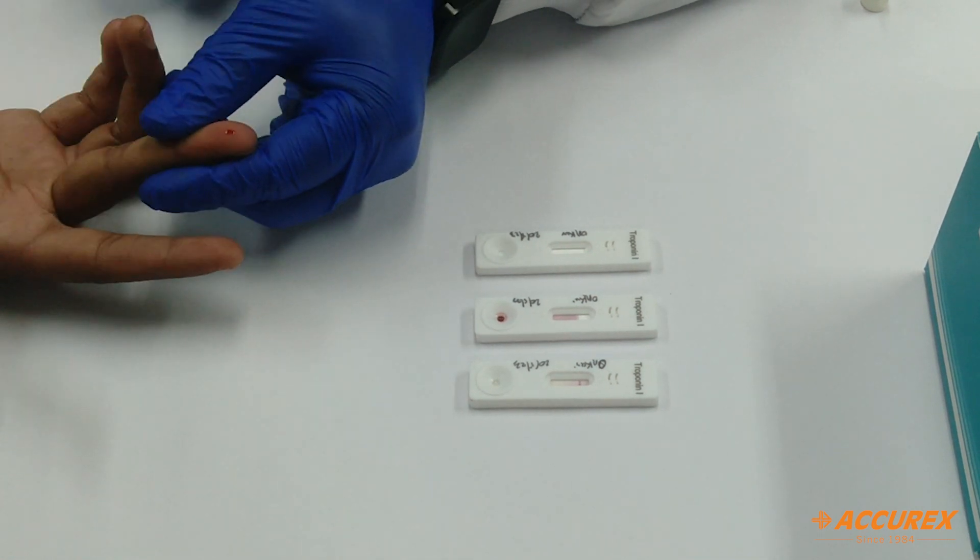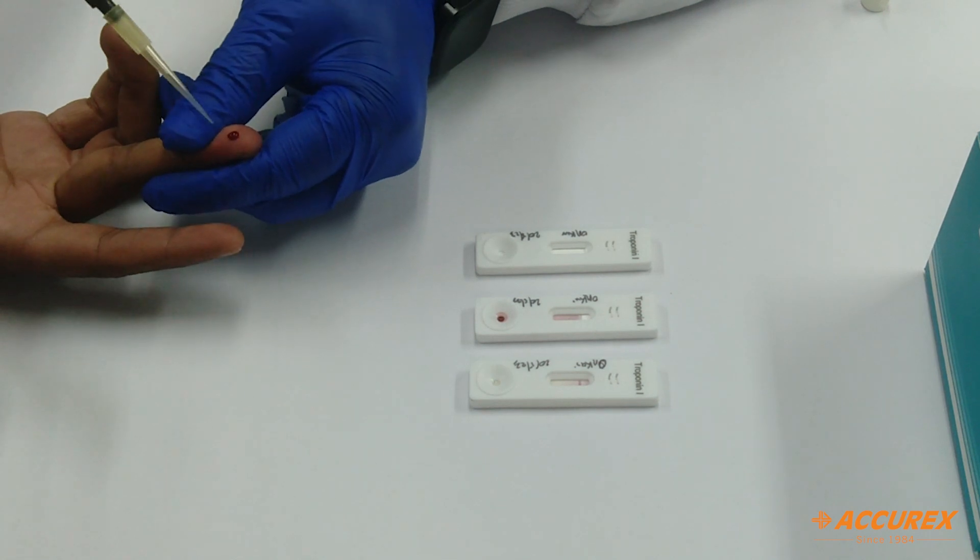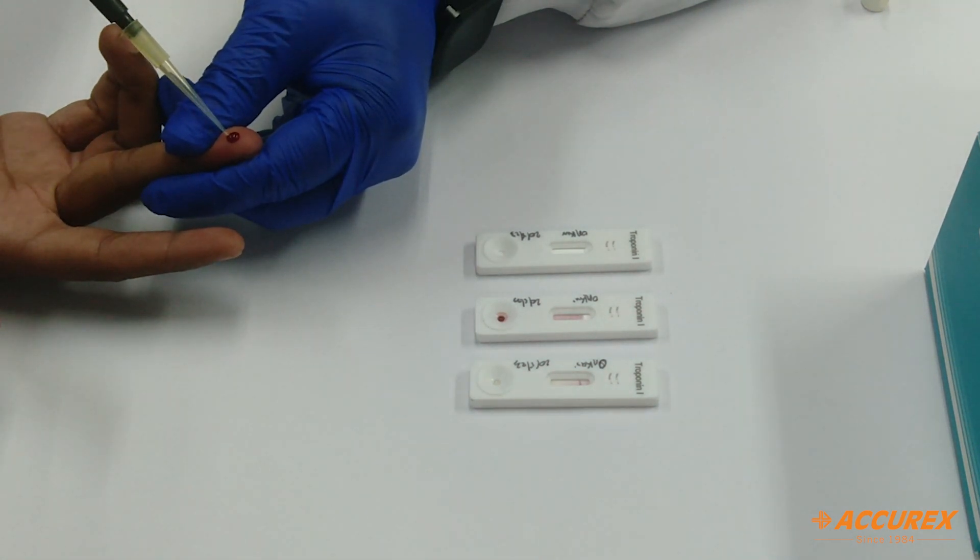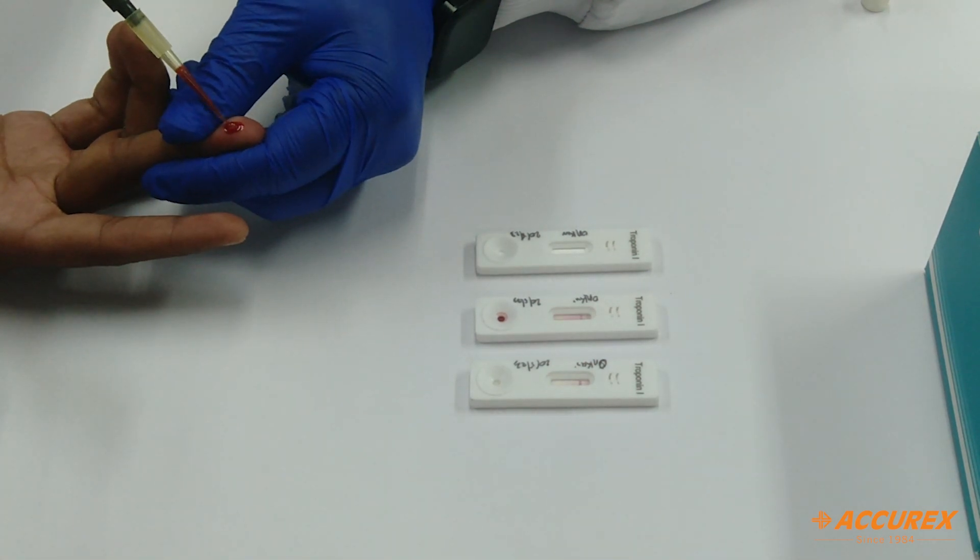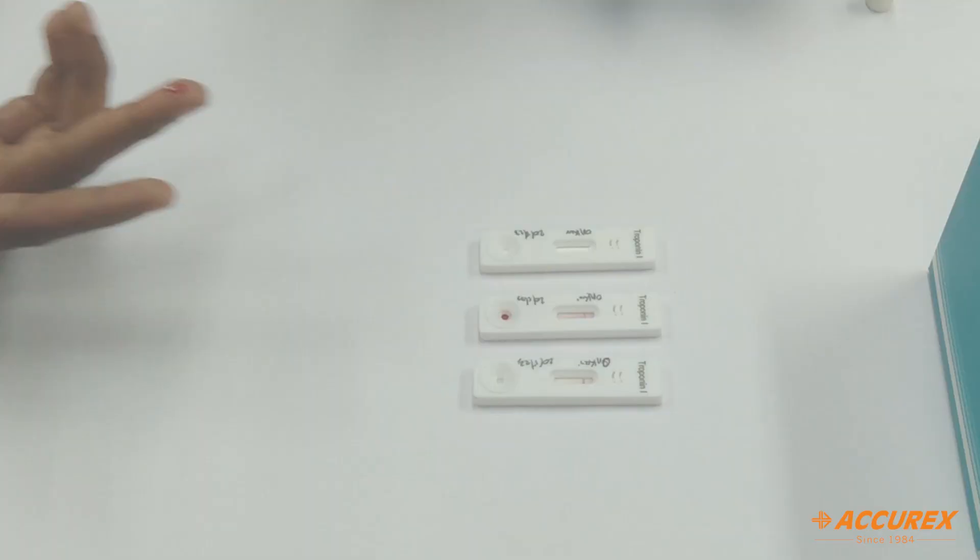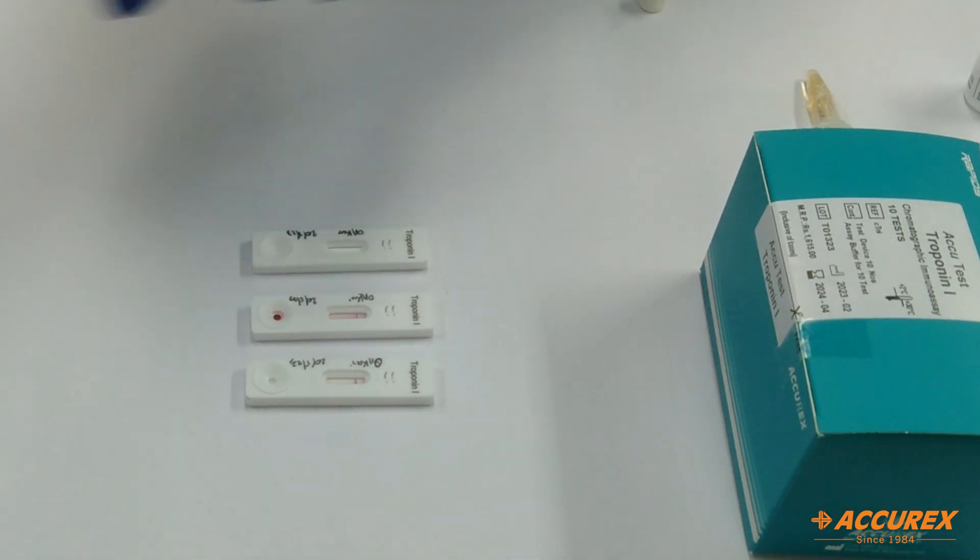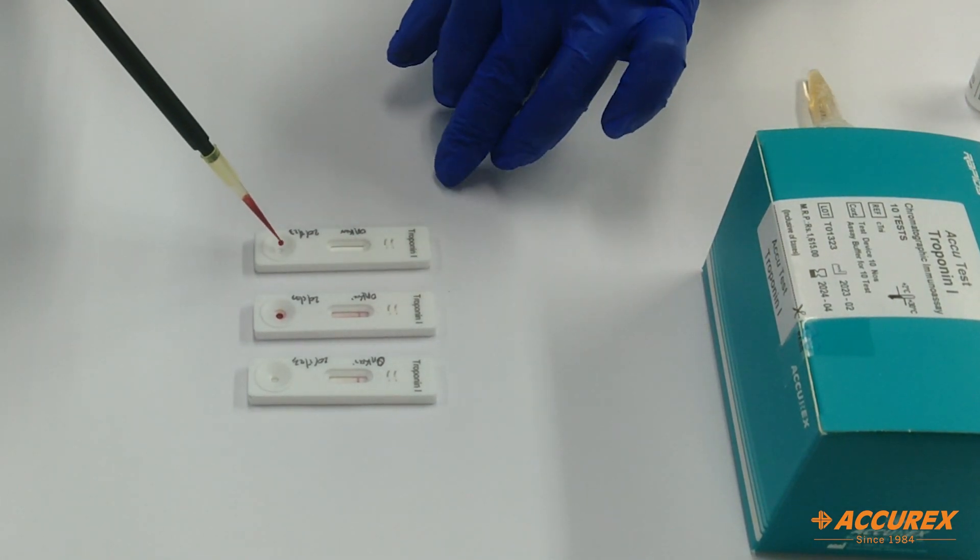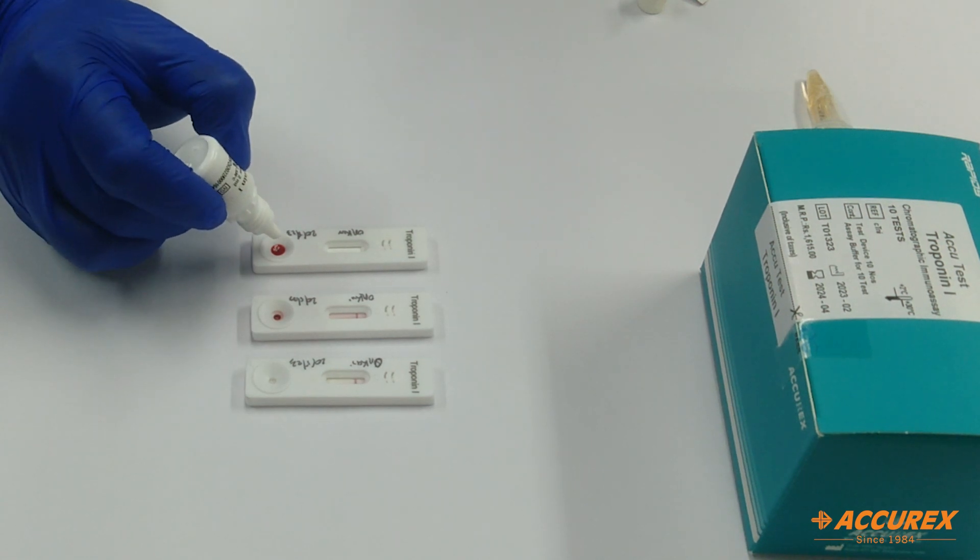Here you need to collect 75 microliters of whole blood sample. We will add this finger prick sample in the well, then we will add buffer.